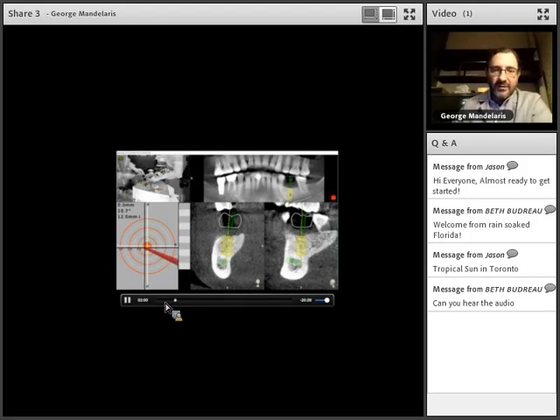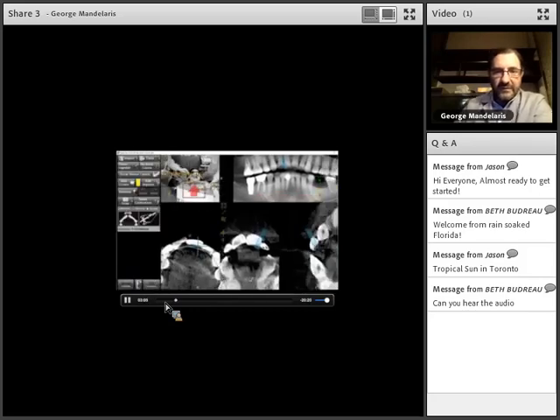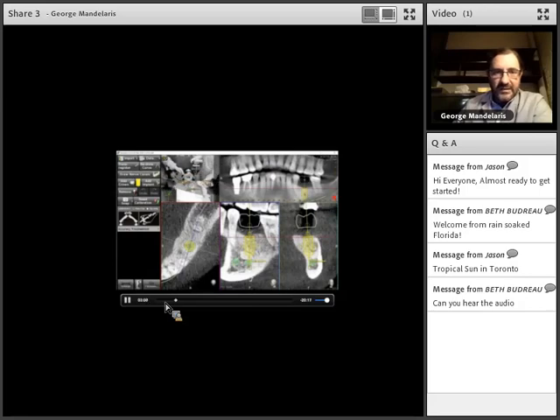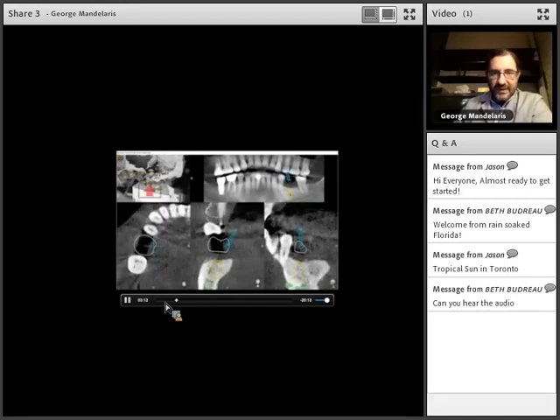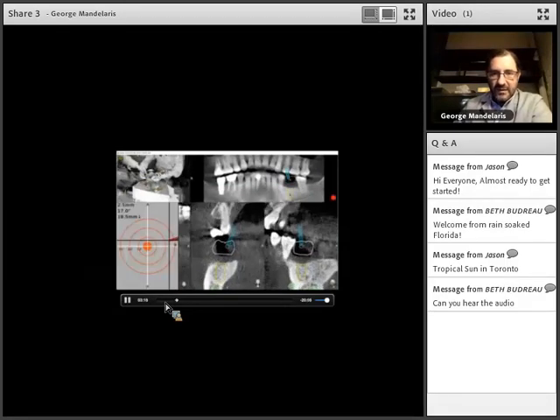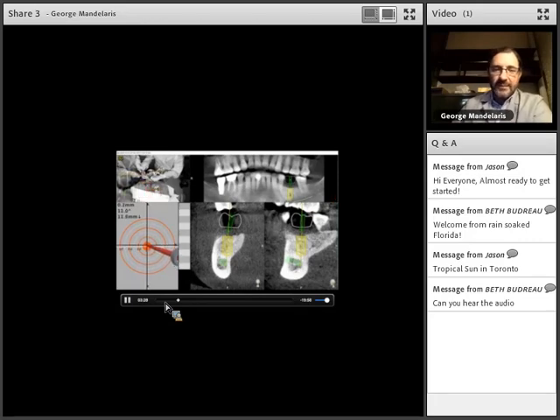I will tell you that there is no better marksman, there is no better sniper in the world than Luigi Stefanelli. He is 100% the best. This is not as simple as it seems, although he makes it look that way. So again, the accuracy check, and then we're going to move back and start our osteotomy site. So what I like to do is try to get the entry point as perfect as I can. I just try to get the tip so it's right there in the bullseye. And then from there, I'm going to work and try to get my angle deviation as ideal as possible.